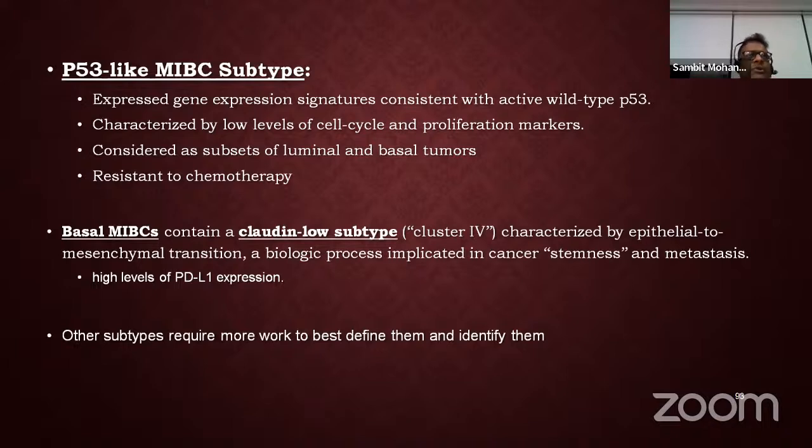So whenever you have a TURBT, now the requests are coming more and more. If you have a muscle invasive bladder cancer, your job doesn't stop there. You probably have to do a few more markers like CK5/6, GATA3, and TP53 to stratify them as basal, luminal, or TP53-type tumor, like the MIBCs, because the therapy and the prognosis are different. And we are also adding HER2 for all our bladder cancers, just to show whether it is HER2 amplified, HER2 overexpressed or not.